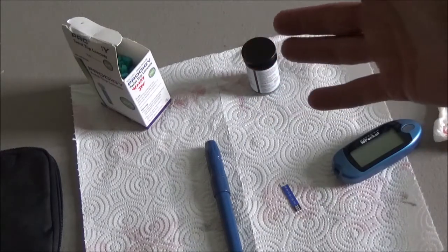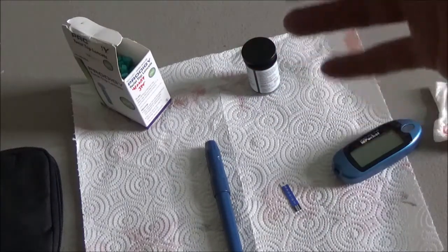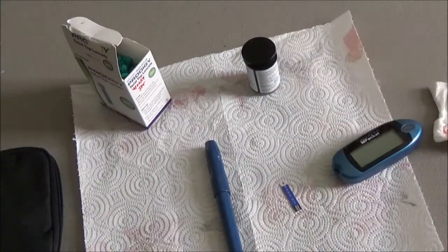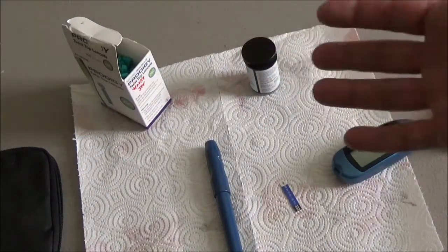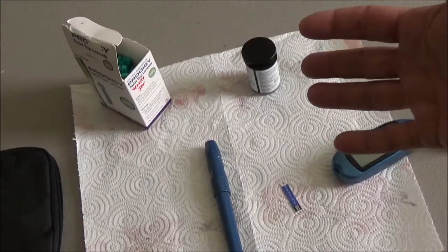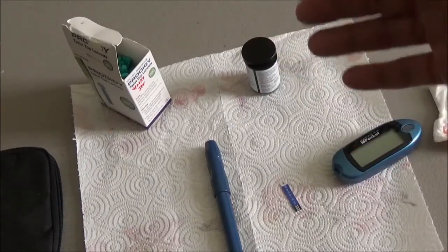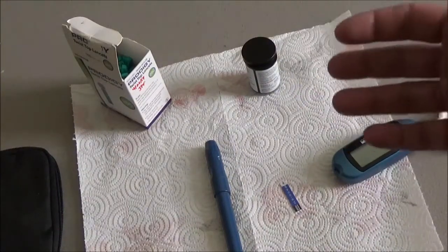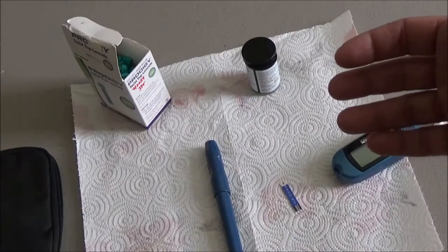All right, physiology students, it's been 30 minutes since I had a meal. The food that I ate, including the sugars, should have hit my stomach and my small intestine and have been absorbed across the wall of my small intestine and into my bloodstream, and so that should result in an increase in blood glucose. Let's see if that happened.